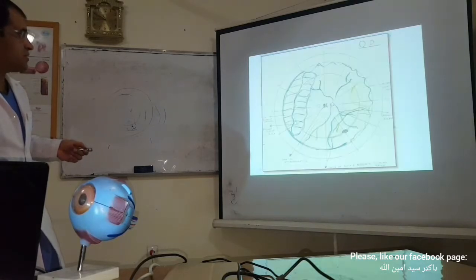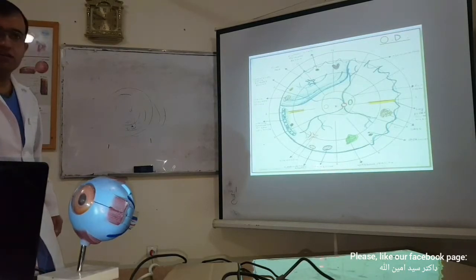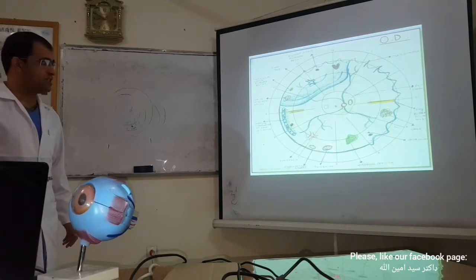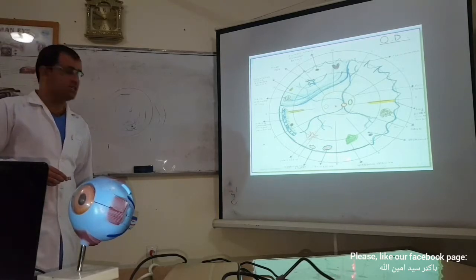Okay, now we have the time is really short. You accept this with me. It is also written thin retina. If the retina is thin, the outline is with the blue color, and the inside is going to be with hatched red lines or with crossed red lines.